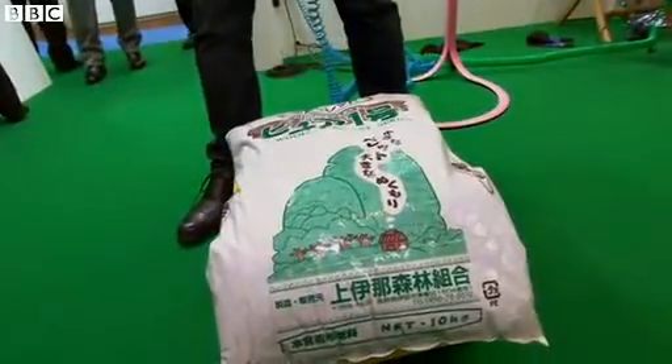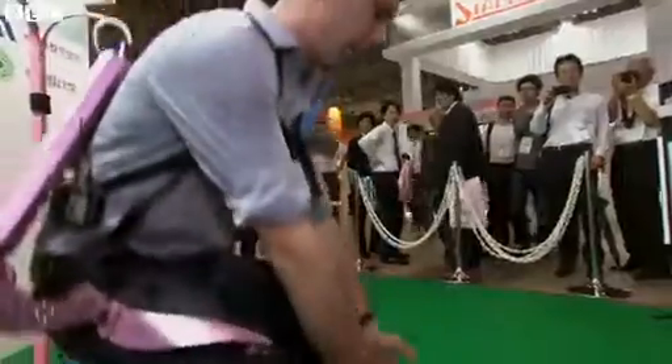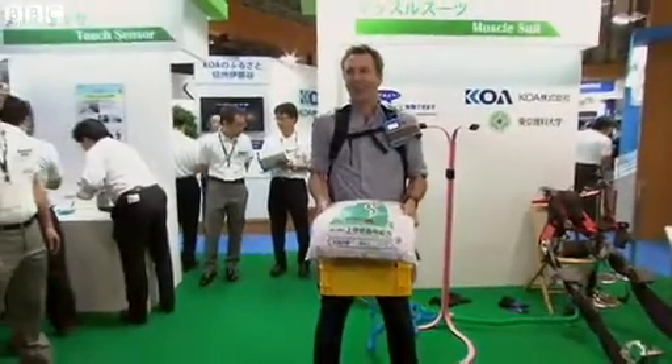This is a 20-kilogram weight, and this is a muscle suit. Ready? Hope my osteopath's not watching this. Oh! Oh! That's weird.